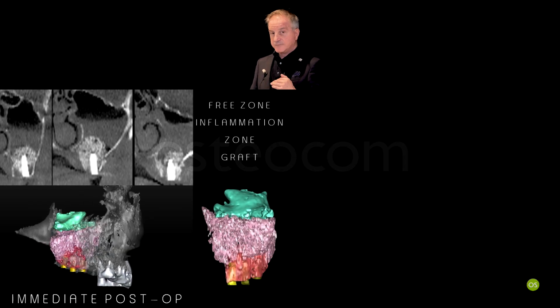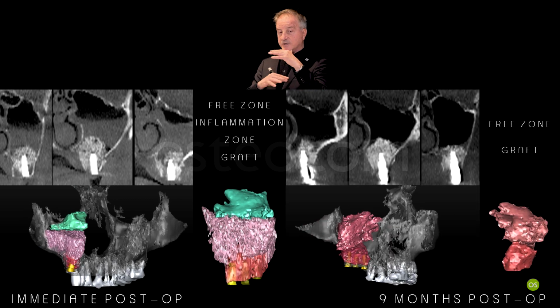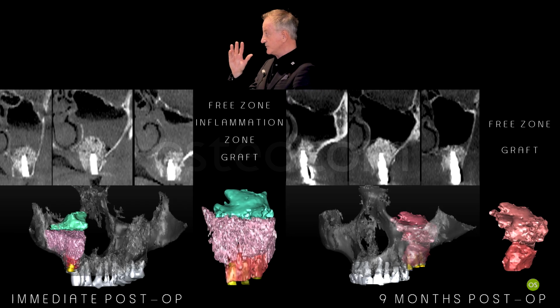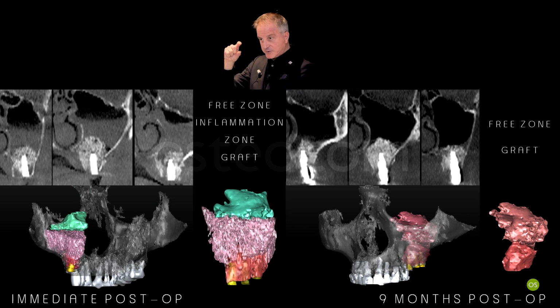We knew that for many, many years, because after the sinus lift, you can have a zone of opacification due to mucus accumulation, because when you lift the sinus, there is a physiological phenomenon called ciliostasis. The cilia stop beating, and you have accumulation of mucus because still the middle layer is producing mucus.